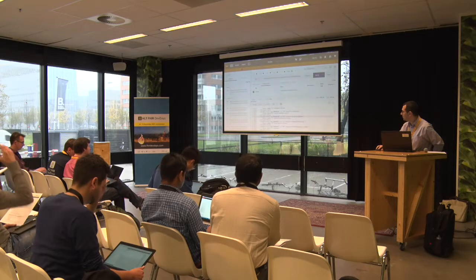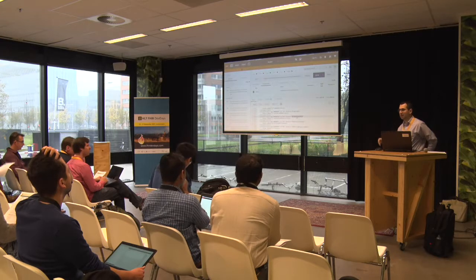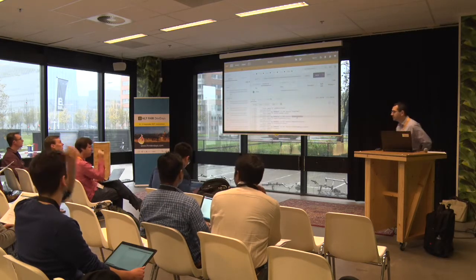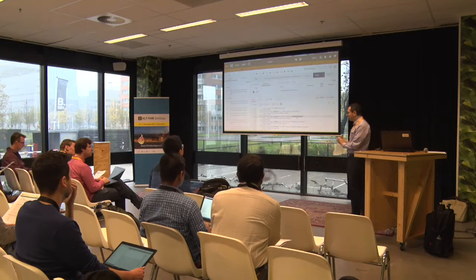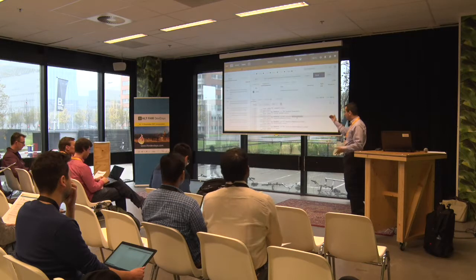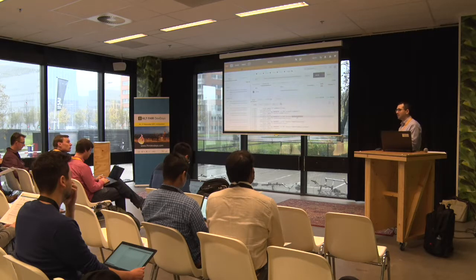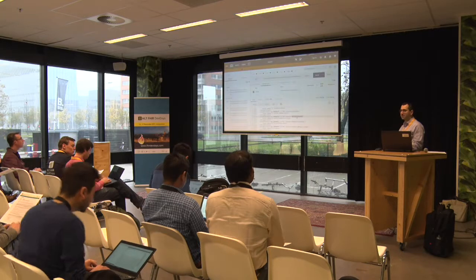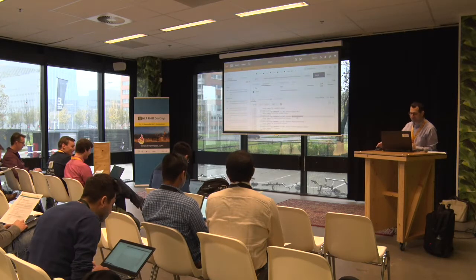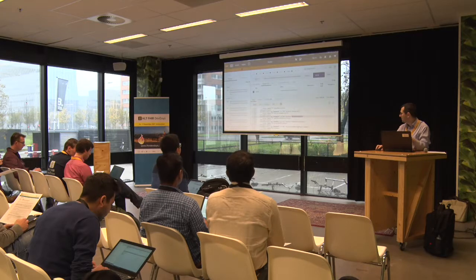And you see for every one of them, there's a tag number. And then usually you'll be provided with a tag, quote-unquote, name. This implementation calls it keyword. And what's the VR? It's a very DICOM concept. It's basically the data type. If you think about integer versus string, DICOM actually has a long list. One of the easiest ways to learn about them is to look at the Wikipedia page for DICOM, which usually has a nice explanation of what VR types are. It's much better than reading the standard for this. Just a little point: VR stands for value representation, and that one is a value type of short string.